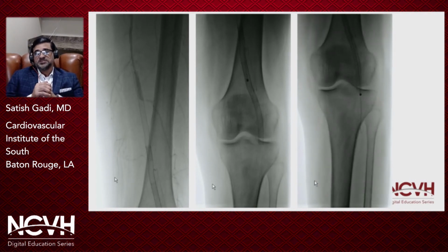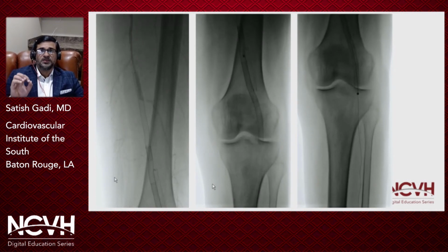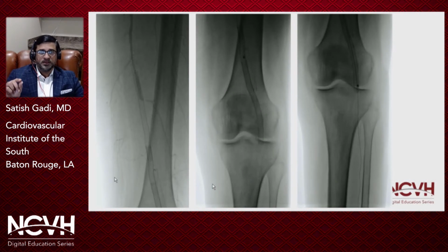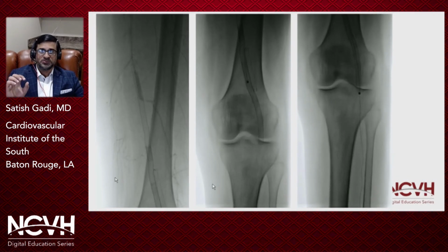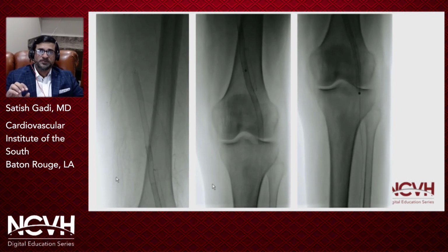Again, one of the things that I learned was it's not easy to cross an occluded Supera stent as well. And one of the techniques that seems to be really effective in enabling good intraluminal crossing of an occluded Supera stent is leading with a laser, a 2.3 mm Turbo Power laser, and letting the laser stay in the lumen. The 2.3 Turbo Power laser is a pretty hefty catheter that will not readily get into any branches or subintimal space. And the laser pulsation will enable the vapor bubble and all the reactions that happen at the front end of the laser to help keep it in the lumen.